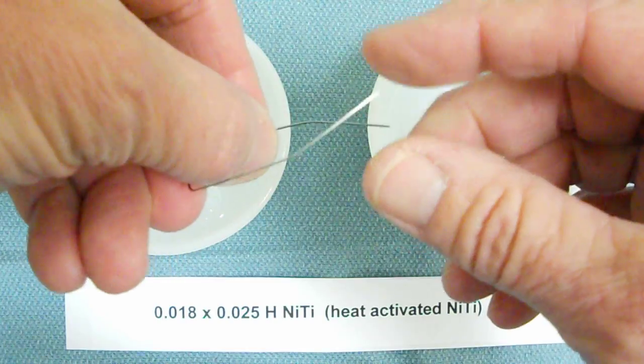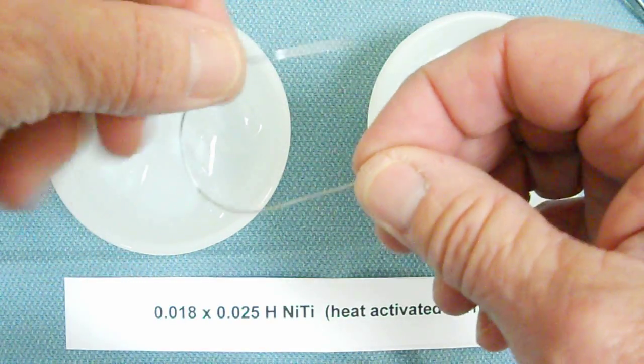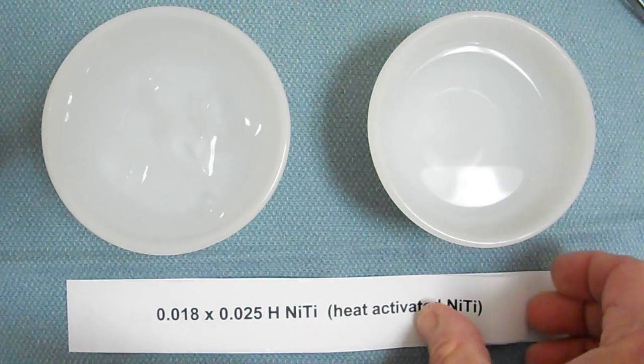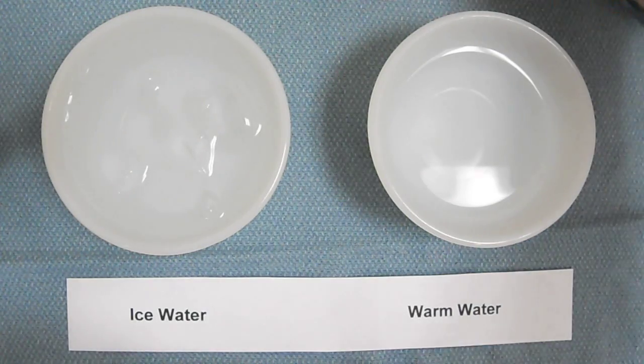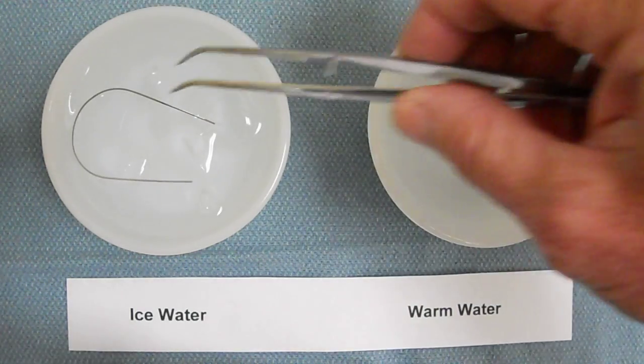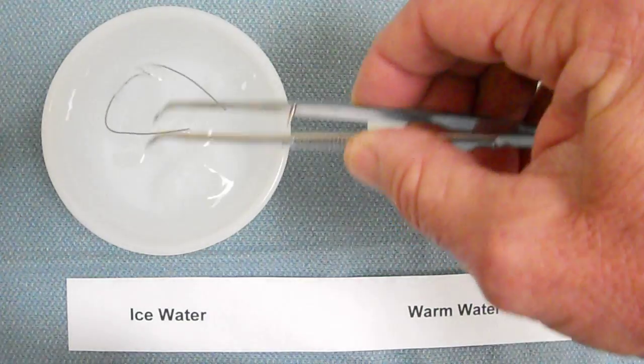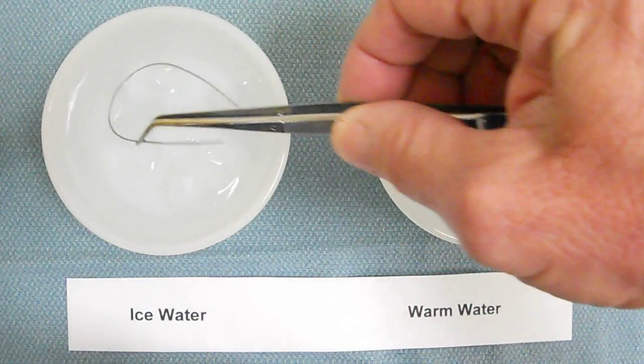The part about the heat activated NiTi: when you chill it, you can see there's ice water here on one side and warm water on another side. When you chill it in ice water like that, it changes phase and turns into a dead soft wire.